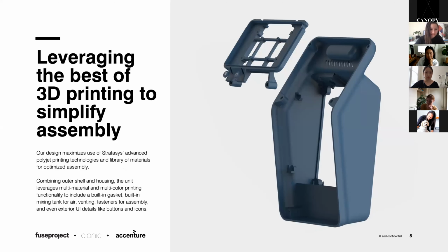Do you want to speak to this one too, Judy? Yeah, here you can see the shell and the housing. There's a gasket that's going to be a little bit softer, and it is multi-material and multicolored. For example, some of the components that need to be color coded can be 3D printed right away. It also allows the mixing tank, venting, and other fasteners to be printed and fixed onto the shell.